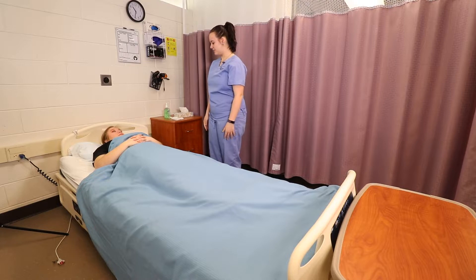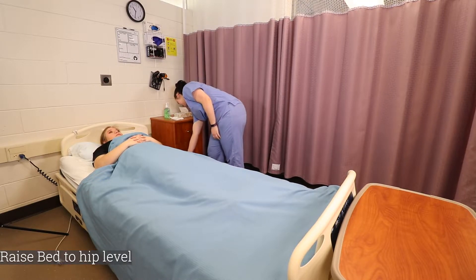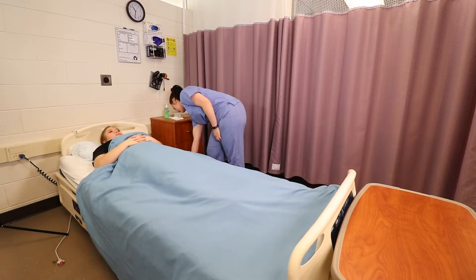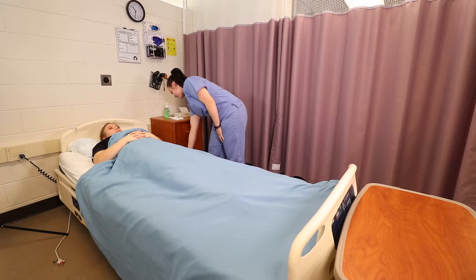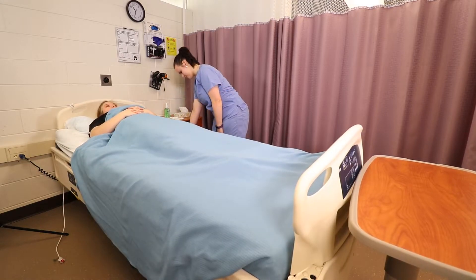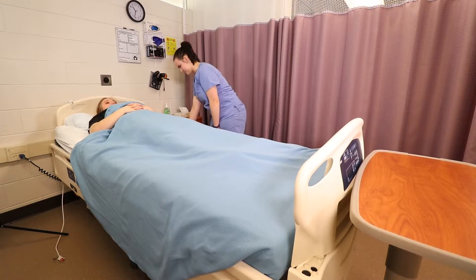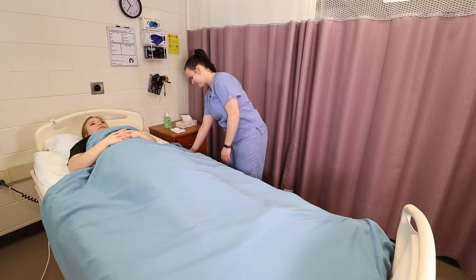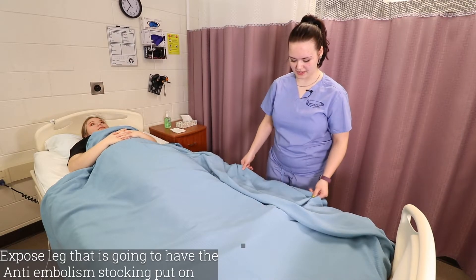I'm now going to raise your bed to hip level. Now I'm going to expose the one leg that I'm going to apply the stocking to.